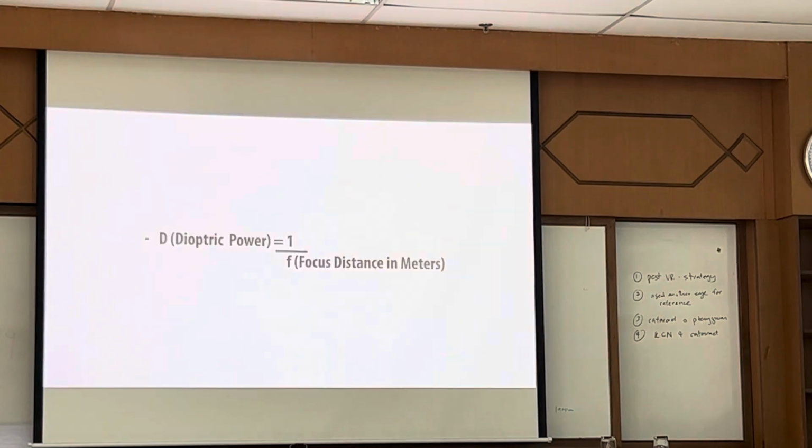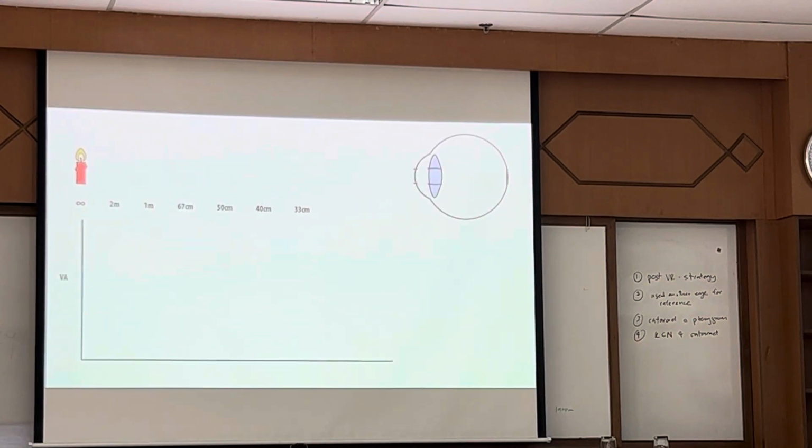playing its role. The minus lens is progressively increasing in its minus power, simulating the image closer to the patient. So let's remind ourselves of the formula: power is equal to 1 over F. Okay? So the same principle applies. First, the image is at infinity, 6 meters. You correct the eye, no more refractive error. Okay? You want to test the IOL.